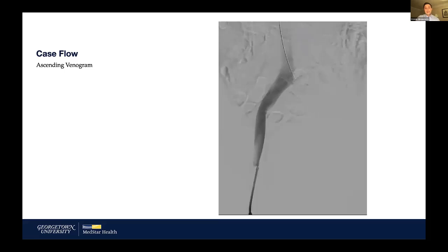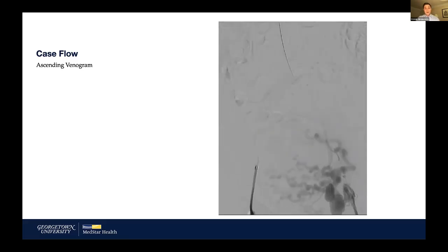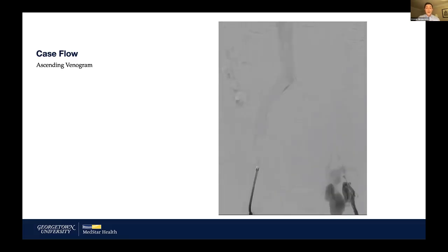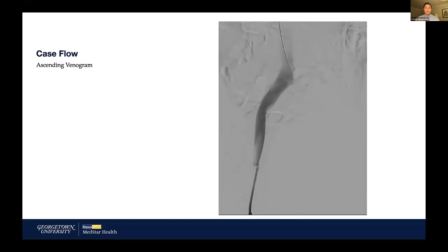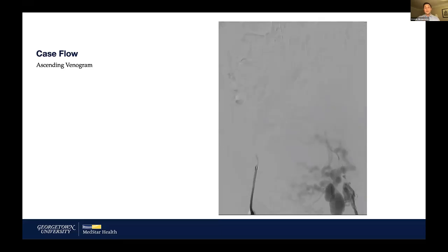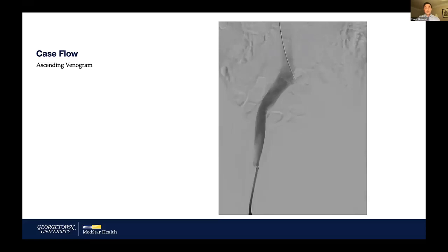This is that same patient. Without showing all the crossing steps, it took about 30 minutes to cross this chronically occluded stent. Once our wire was across, I also got contralateral access. The reason for this was that with RevCore, you are generating material as you use the device within the stent, and I found it very useful to use the Protrieve sheath to capture that material in the IVC so I can analyze and aspirate it from the body.